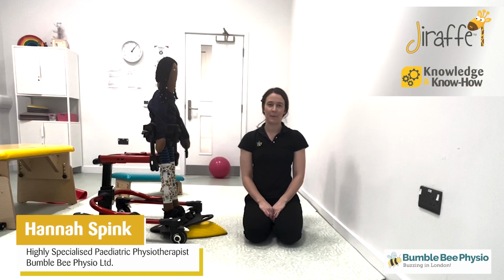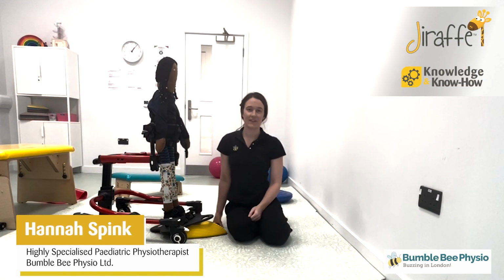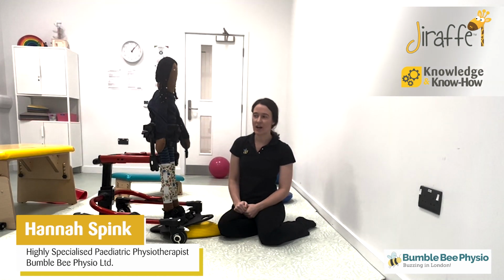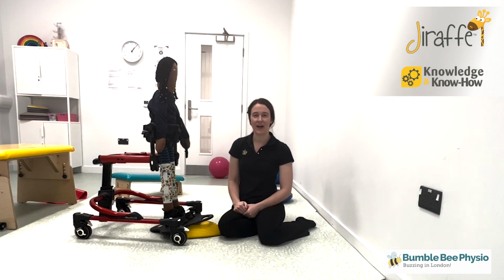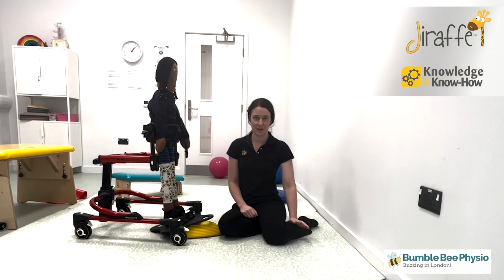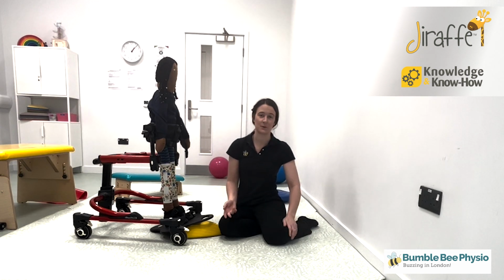The next thing I want to talk about with the Rifton Pacer gait trainer is the ability to give a dynamic stretch to our children. A dynamic and active stretch has so much more evidence behind it than a passive stretch. Lots of the time, children have tightness in their hamstrings and also in their gastrocnemius, which is the bigger calf muscle, the one that also attaches above your knee and not just below your knee and the ankle.